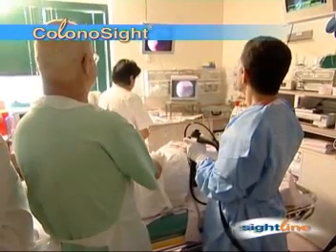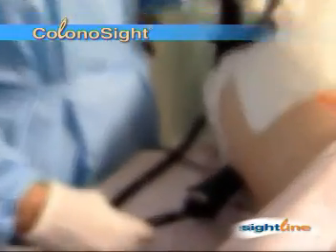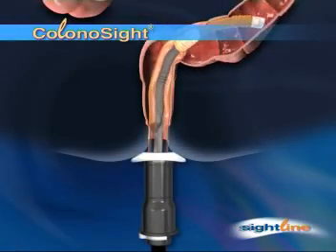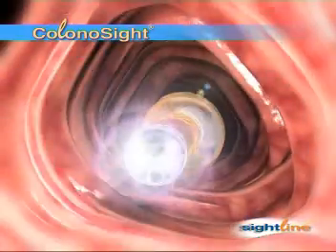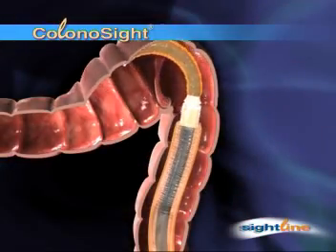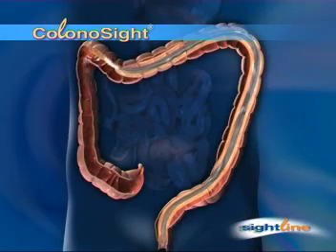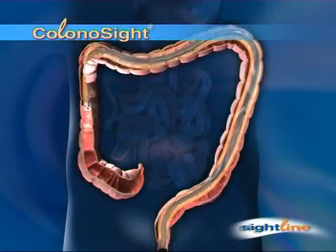It looks like traditional colonoscopy — the patient on the examining table, the procedure room — but there's a revolution going on inside. After Colonosight is inserted, the physician navigates through the curves of the colon with impressive ease. The procedure is more secure because the scope adapts to the colon's form.